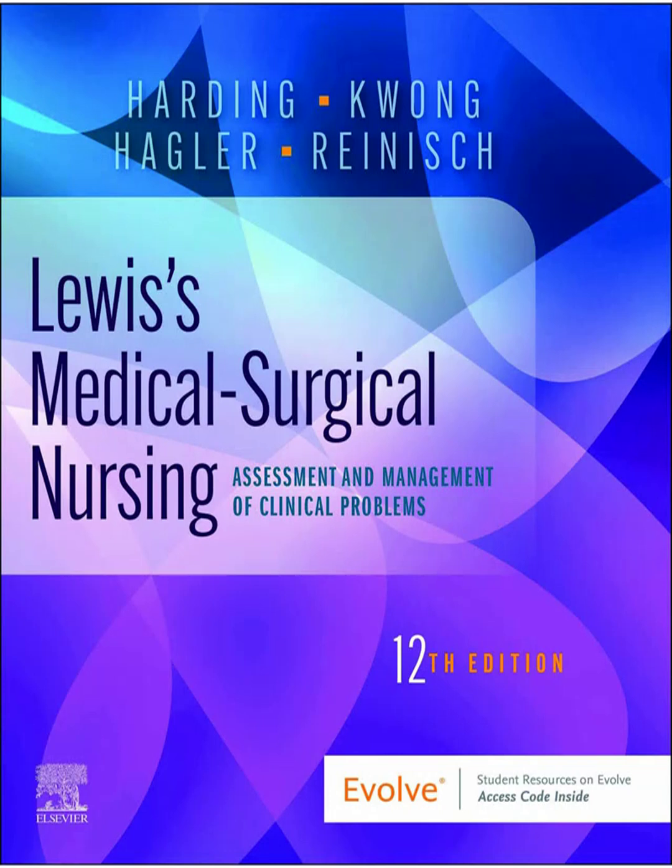Good tip. And what if a pacemaker isn't working right? Malfunction. Yeah, nurses need to be able to spot pacemaker malfunction on the ECG. 3 main problems. Failure to sense. The pacemaker doesn't see the patient's own heartbeats when it should, so it might fire inappropriately, too close to the patient's own beat. You'll see pacer spikes where they shouldn't be.